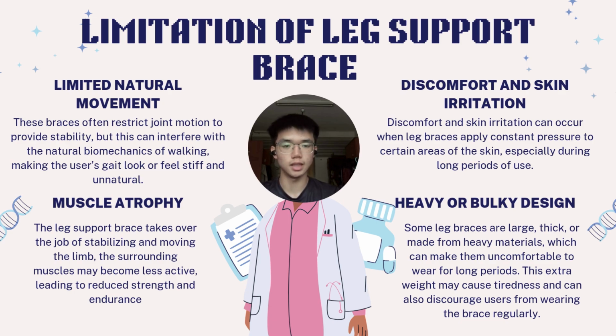The second is discomfort and skin irritation. Discomfort and skin irritation can occur when a leg brace applies constant pressure on certain areas of the skin, especially during long periods of use. The third is that a leg support brace can lead to muscle atrophy. The leg support brace takes over the job of stabilizing and moving the limb. The surrounding muscle may become less active, leading to reduced strength and endurance.